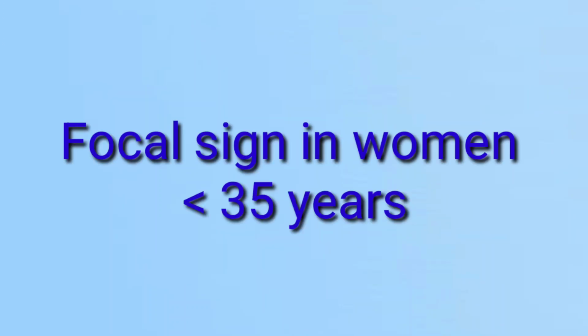Ultrasound of the breast is recommended for women with focal signs and an age of less than 35 years, recommended by these three health professionals: clinicians, radiologists and pathologists, to assess in their clinics or in multidisciplinary diagnostic breast clinics.